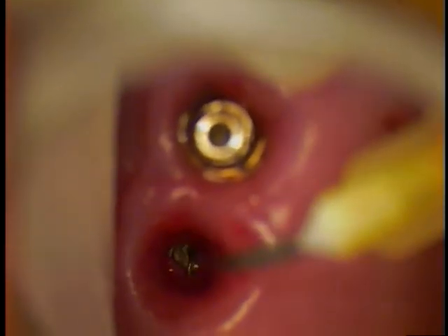So right now, I'm going to leave it alone. The tissue will grow over it. That's okay, as it's titanium. It might just bury itself. And leave well enough alone. There's no need to put anything down inside. There's really nothing I can do to put anything down inside of it without having to back it out again. It's impossible to seal it because of the jaggedness of the top of the implant.